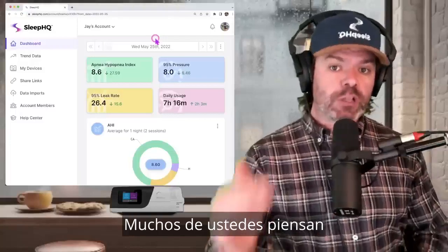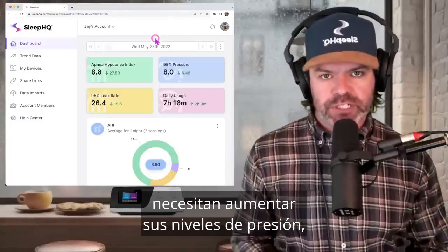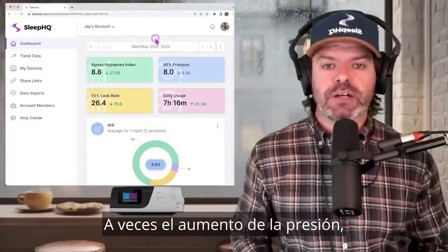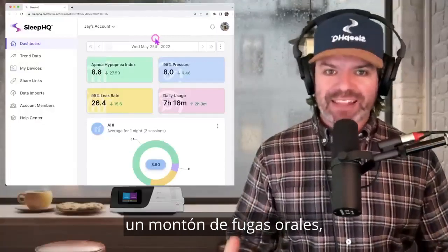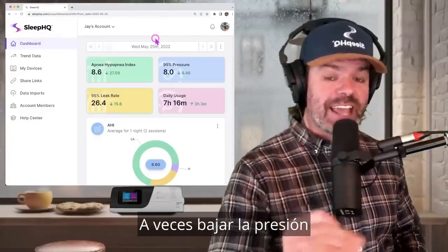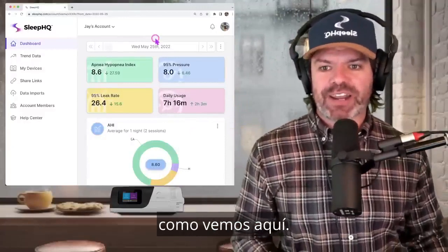Many of you think that in order to lower your AHI numbers, you need to increase your pressure levels, but it's not always the case. Sometimes increasing your pressure only causes a whole bunch of mask leaks, a whole bunch of mouth leak, and then you end up in that death spiral. Sometimes bringing your pressure down can actually improve your results, like we see right here.